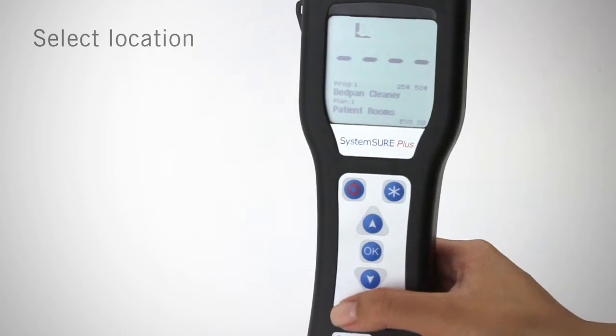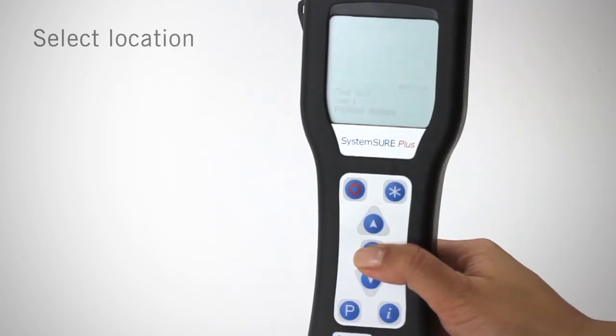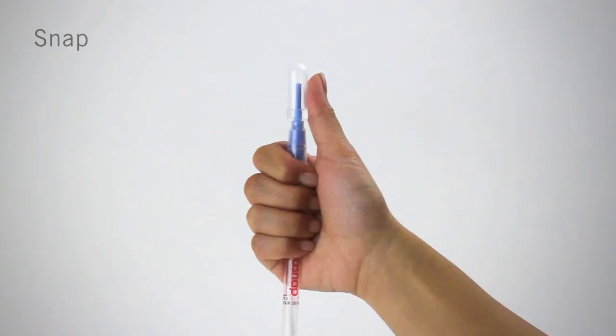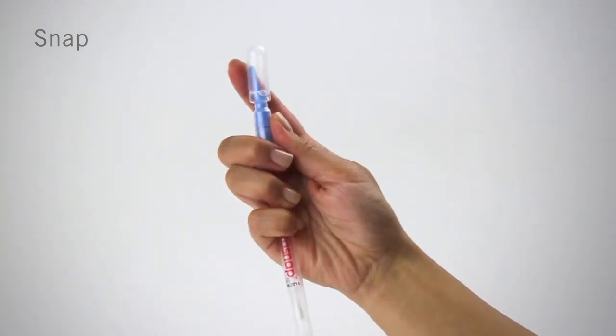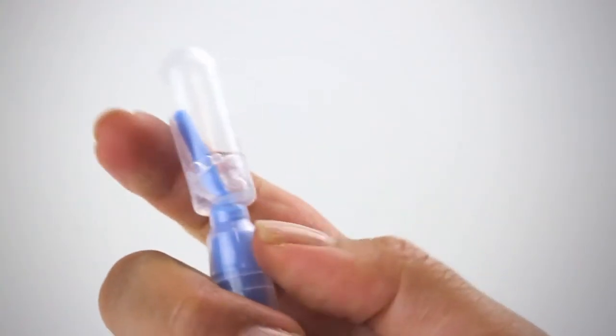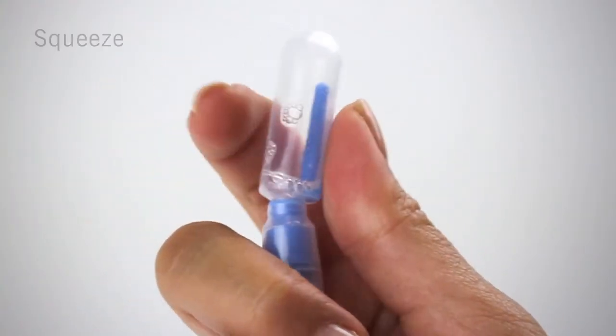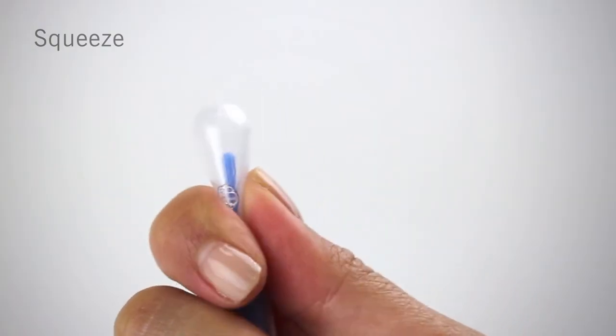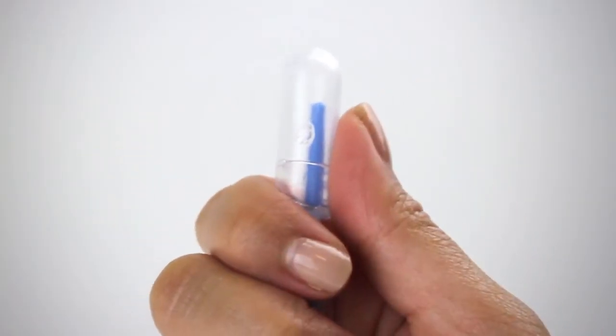The second step is activation. Turn on the luminometer. If you program locations, select the location to be tested. The easiest way to activate UltraSnap is to hold the device in your fist and use a thumb and forefinger to break the snap valve by bending the bulb forward and backward. Then squeeze the bulb twice to expel liquid into the tube. Now shake for 5 seconds.